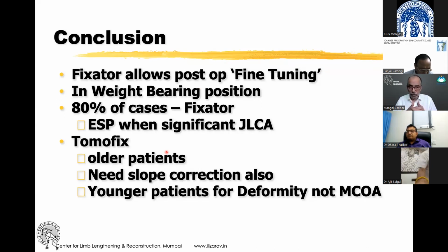I do use the Tomofix in the remaining 20% of the cases, but these are usually older patients, or patients who, in addition to the correction of varus valgus, need a slope correction also, because the Tomofix allows us to take care of the slope. With the fixator, you cannot change the slope.